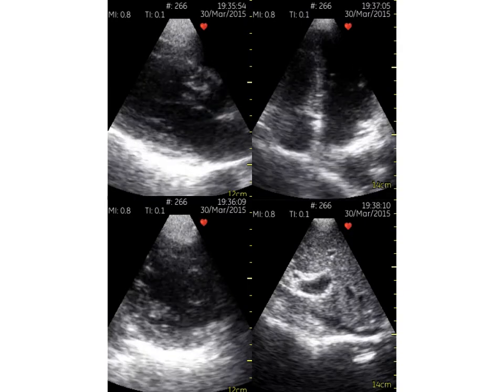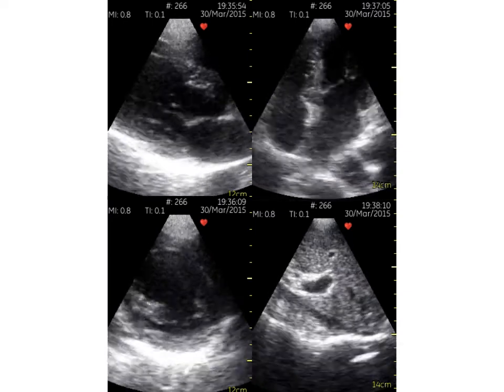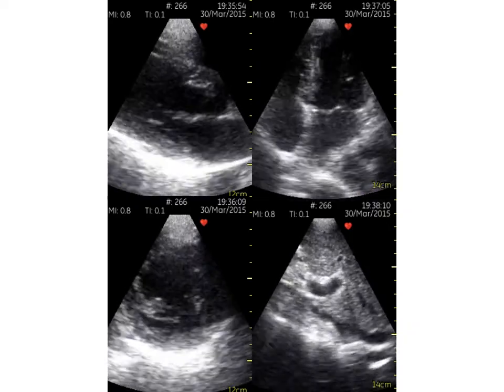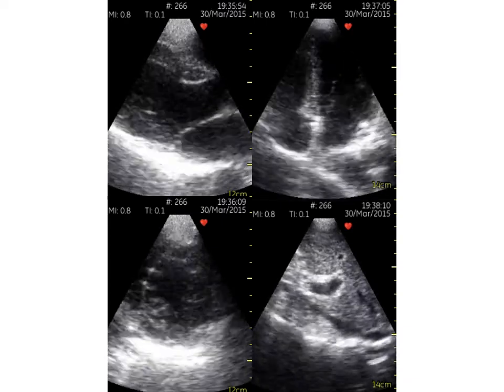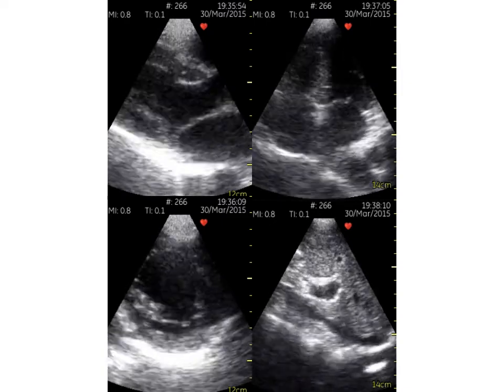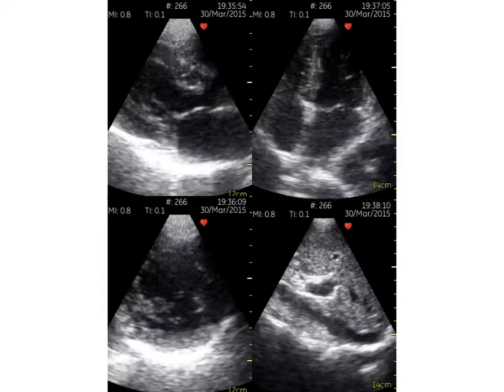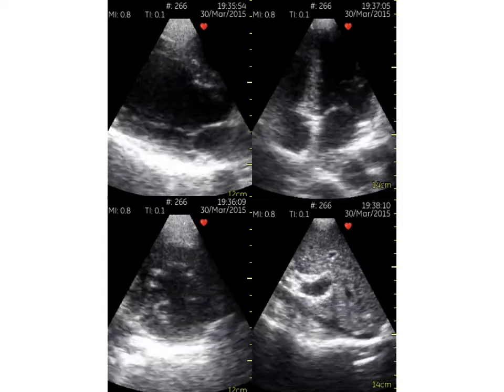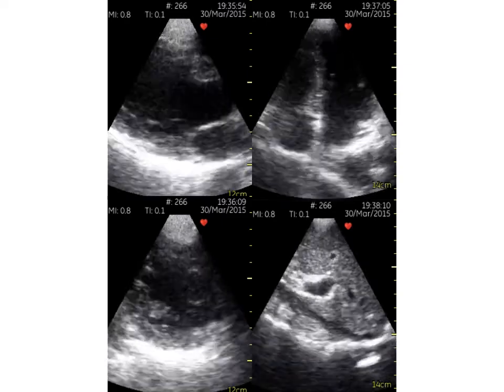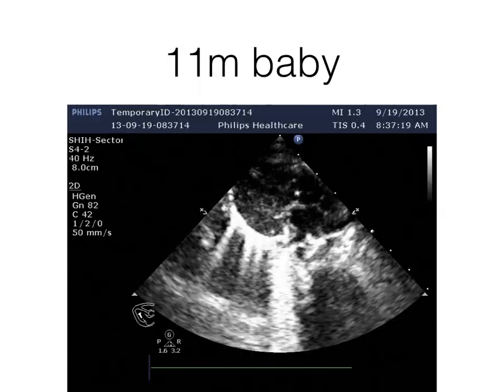How about this situation? If the patient develops hypovolemia or hypotension, what can we do? Fluid. Why? Because you see collapse, kissing of the IVC. So that means the patient can be resuscitated with fluid first. How about the heart? Contraction is good, right? So you don't need to add inotropic agents. So it can guide your management and resuscitation.